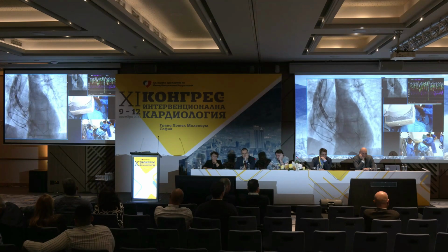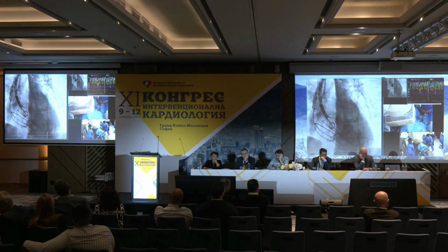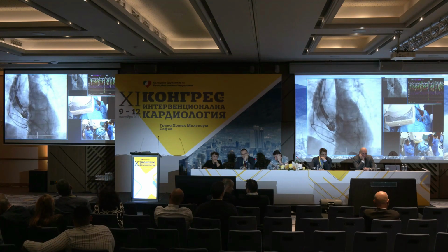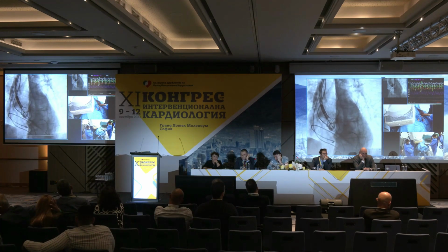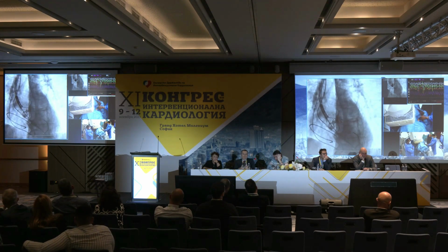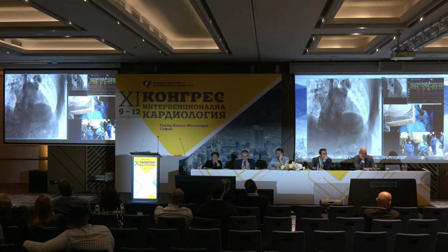Go next. Yeah, this is the check after the click. So, in fact, we stopped rapid pacing in order to check the position and hemodynamics and so on. And we were happy. It's some kind of position 1. And okay, go next.